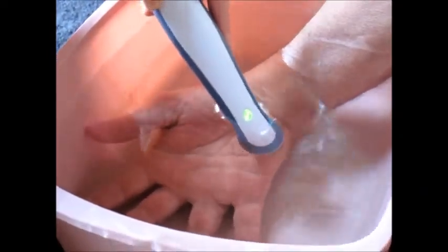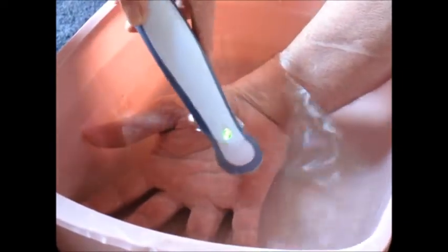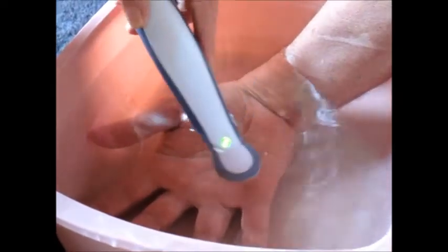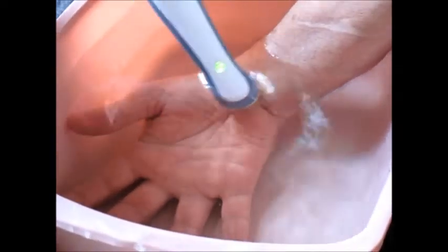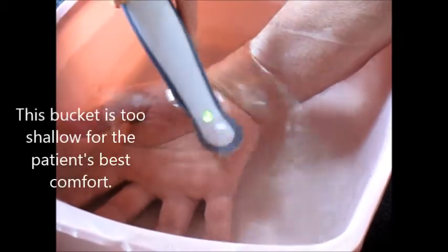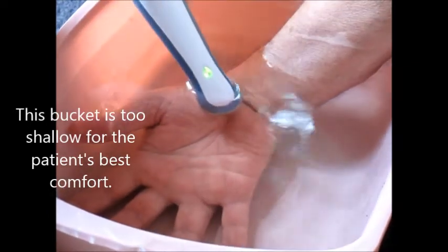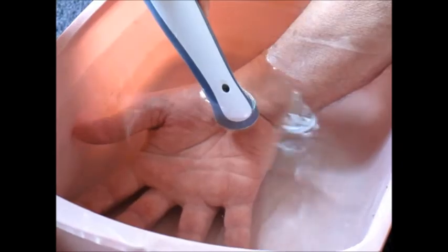Right now I'm just using different patterns, and you can see I'm using a movement pattern of about 1 to 4 centimeters per second — that's the speed I'm supposed to use. It's not comfortable for the patient, so I don't like to keep them here too long. I usually use a little bit longer bucket to get a wrist in there and kind of flat. Now I'm going to hit the off button and turn it off — thank you very much.